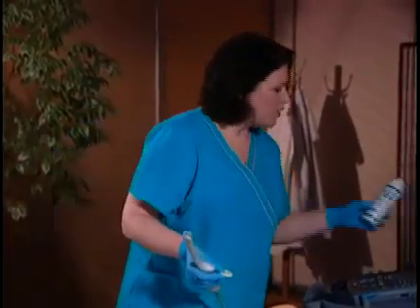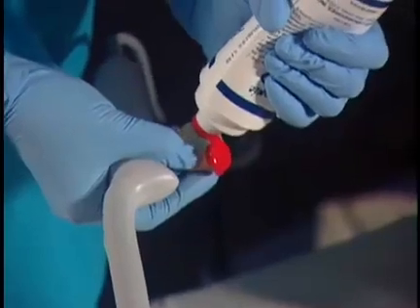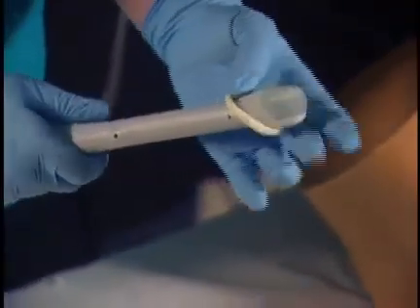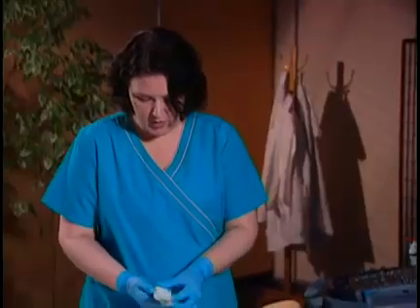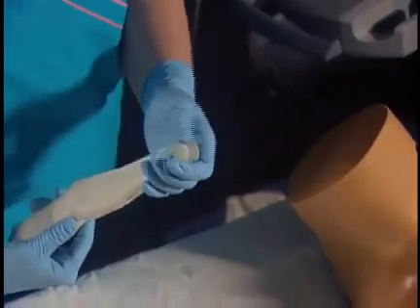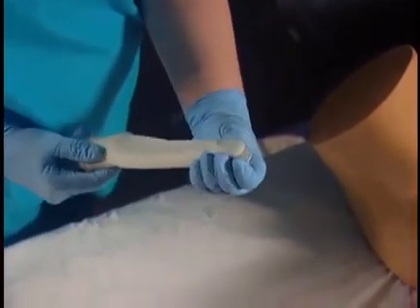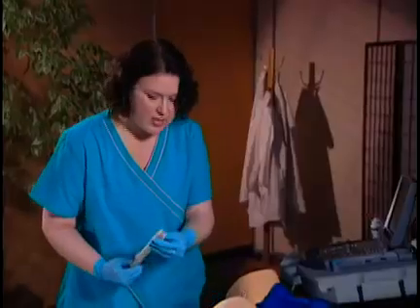So we'll put a little bit of gel inside the cover, position that over the tip of the transducer, and then pull down the covering over the transducer and right over the handle so you've got good coverage. Then make sure you examine the tip and eliminate any air bubbles covering the transducer face. Once you've got the air bubbles eliminated, you can move on to the next step.